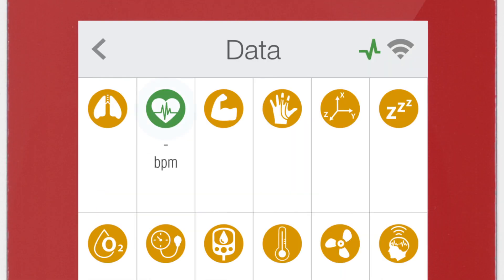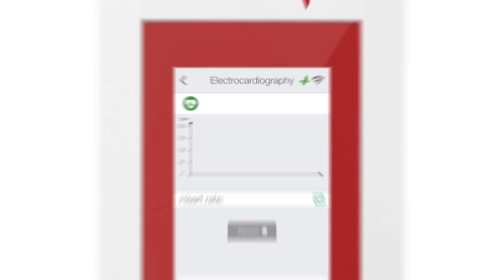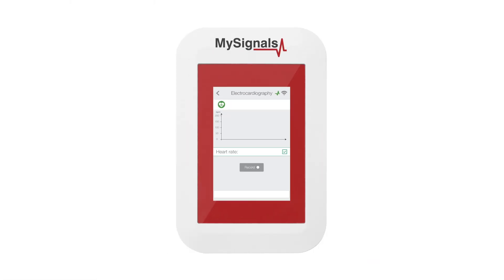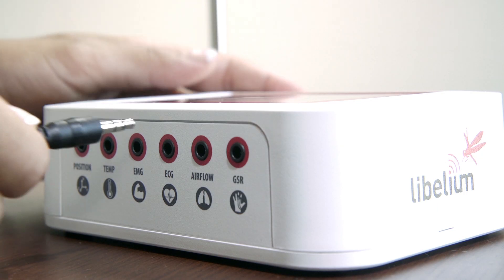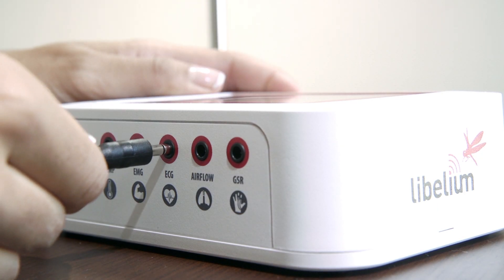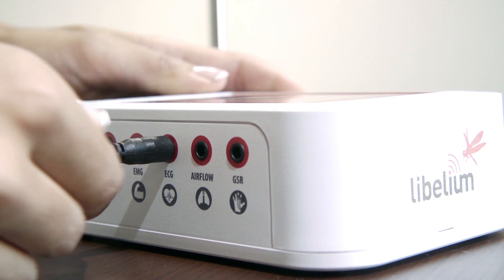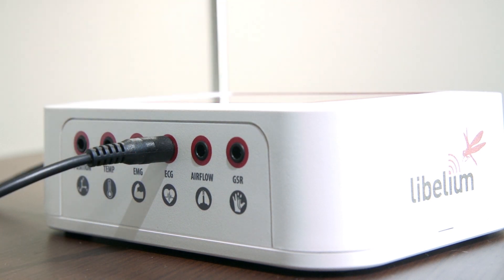Click on the Sensor icon to start real-time data visualization. Connect the jack sensor in the ECG connector indicated in the MySignals hardware device.